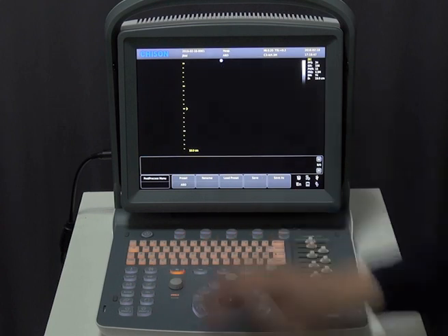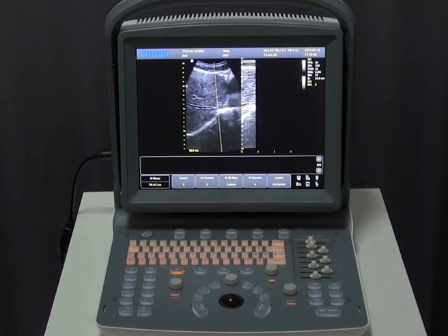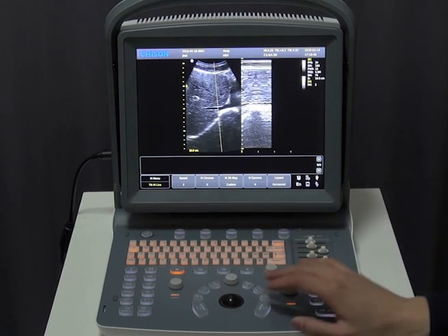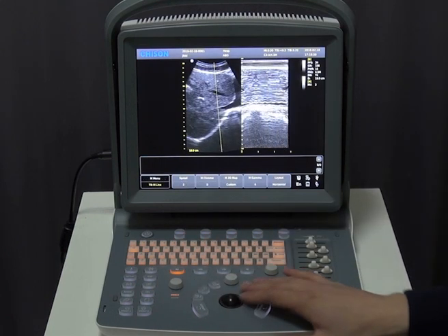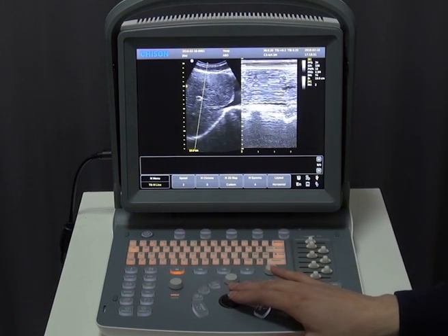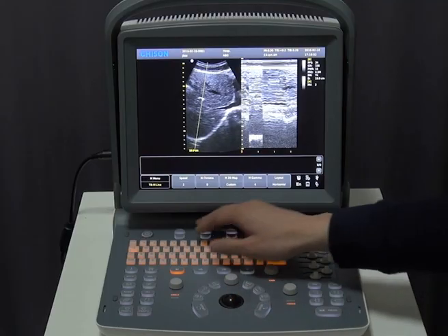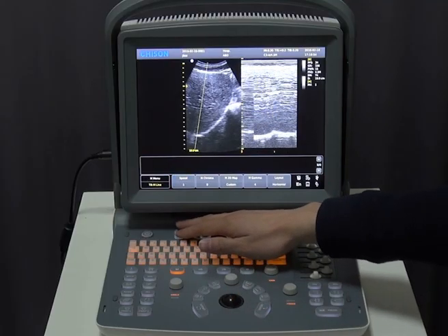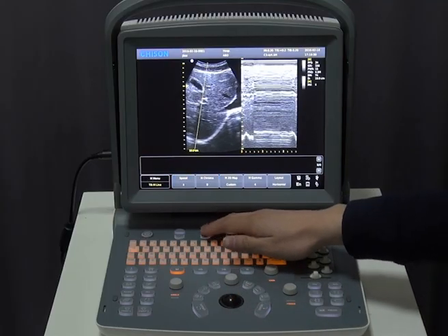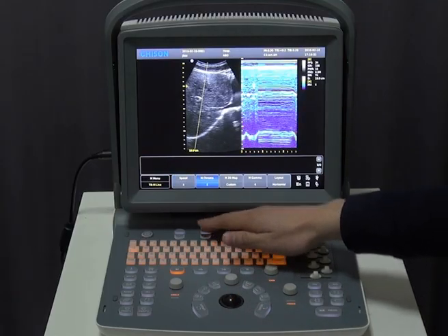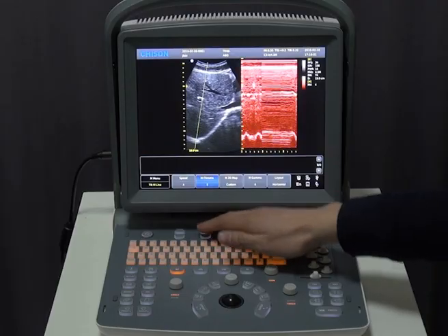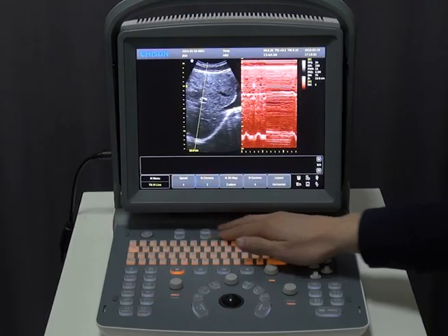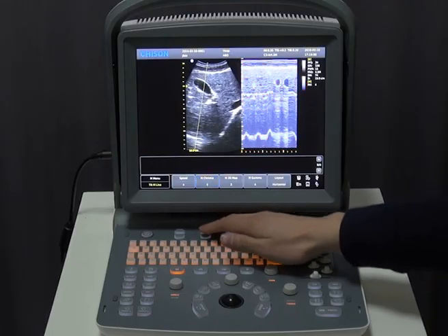This is M mode. When we use M mode to scan the image, you can adjust the speed. There are also eight types of M mode chroma, which will certainly satisfy your needs.